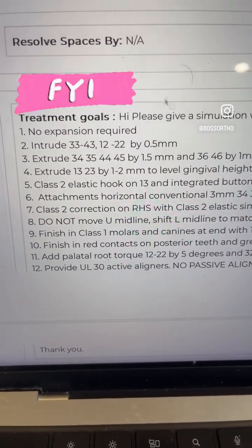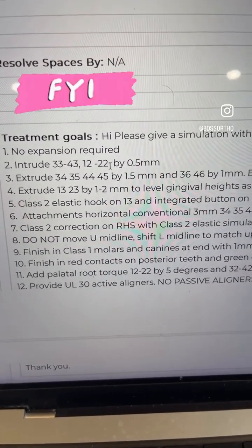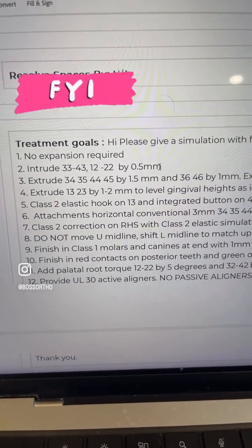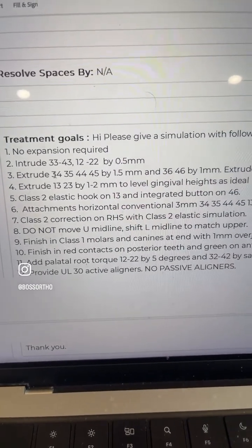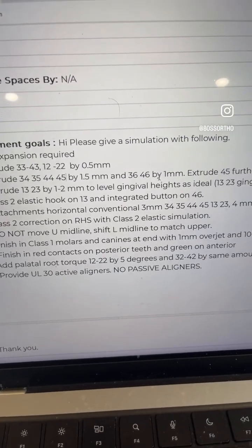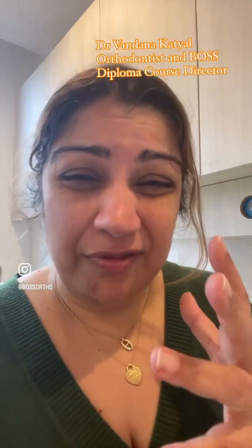I'm telling them how much to intrude my 3-3 to 4-3, my lower canine to canine, and upper lateral to lateral by a slight amount, because a lot of the deep bite correction is going to come from posterior extrusion. But I'm telling them to extrude all my lower premolars by quite a lot, 1.5 millimeters, but the lower molars by only 1 millimeter, because this is only for a draft simulation. I can't expect that just from these point notes the technician is going to get it right, but I'm going to get a simulation that is kind of like what I want.